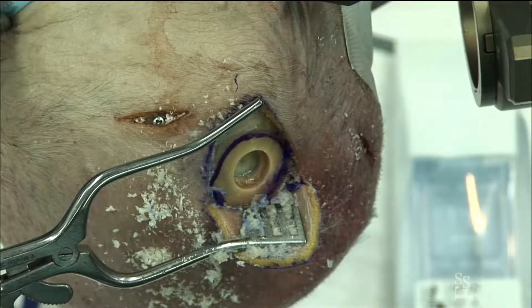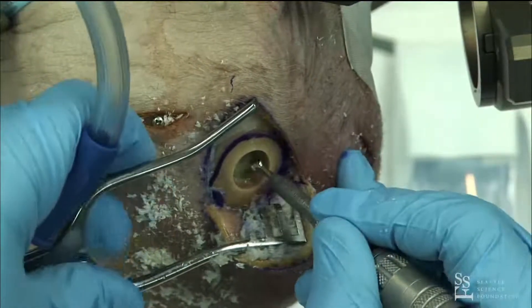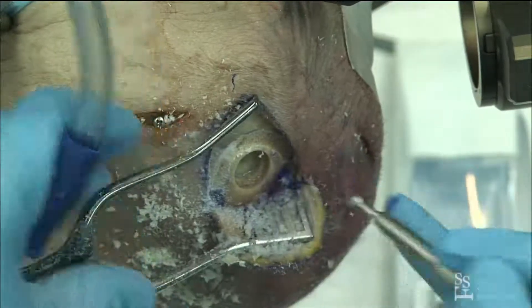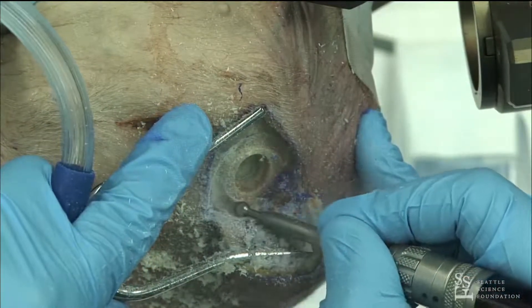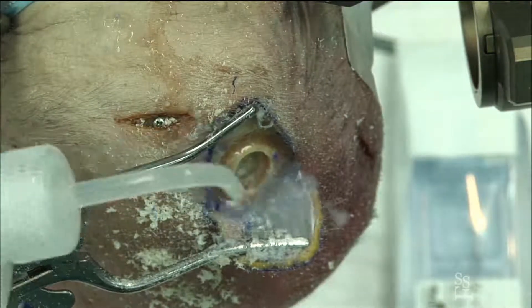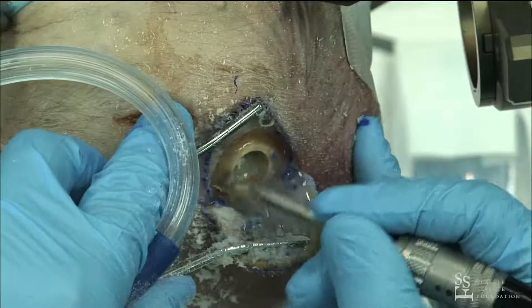So we've marked out — I'll usually use a sterile pencil for this step. So then for the countersinking, just a little few minutes for aesthetics. I go right on the mark. And this is where I'm going to get CJD one day from getting all this bone dust in my eyes. I'm going to irrigate a little bit. Just kind of level everything out.